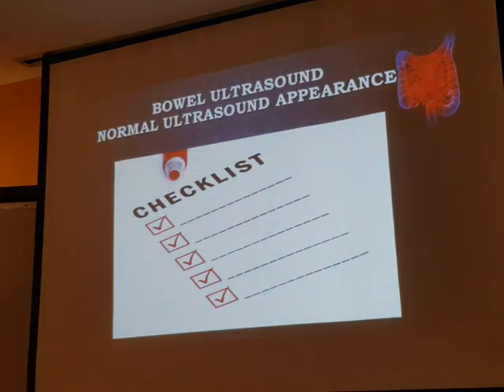So you have your normal anatomy. The normal anatomy is very important to have easy access to your examination part. This is our tool, our first step as sonographers: know your anatomy very well, just to be specific, to put your probe where it's of interest. After you know your anatomy very well, know how it looks by ultrasound, to better evaluate it and recognize it easily. After that, you have to collect data.